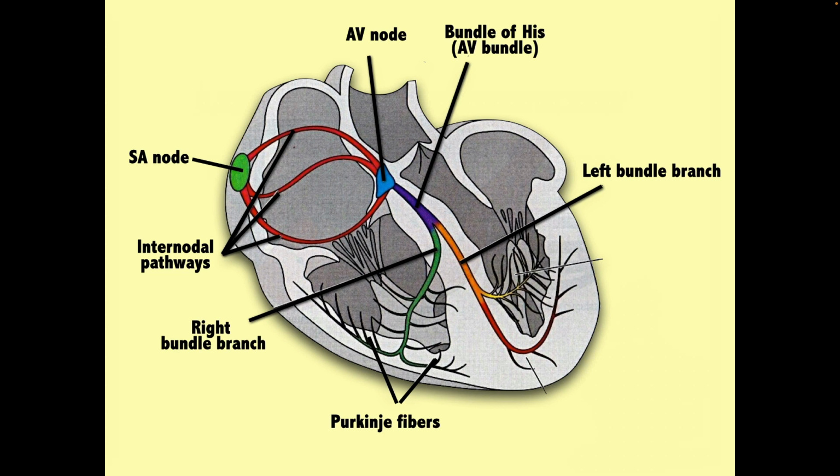Still a sinus rhythm, but suppose a bundle branch block, which is something wrong with the speedy conduction system. The impulse gets here, expecting to hop on the speedy conduction system, and can't do it. That doesn't mean the ventricles can't depolarize. It just means they don't have the conduction system, so we're back to that slow cell-to-cell depolarization, okay?